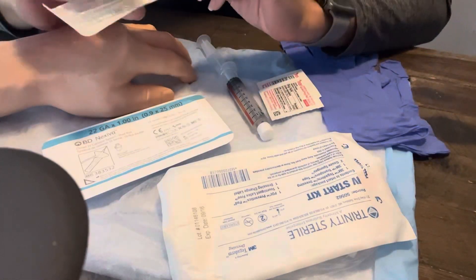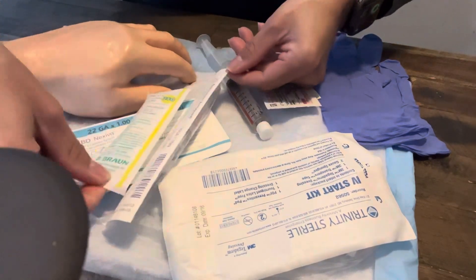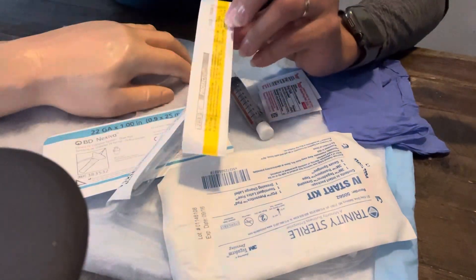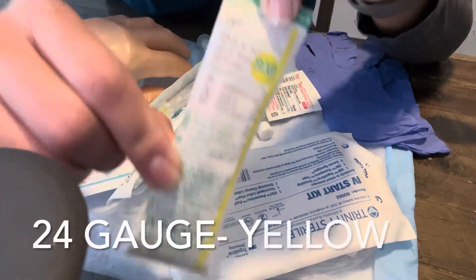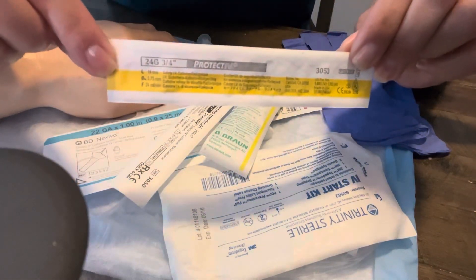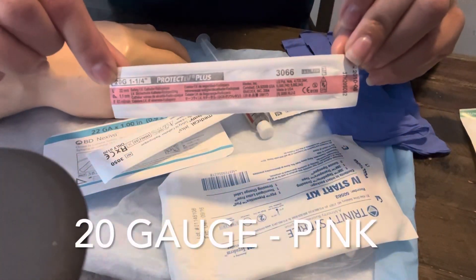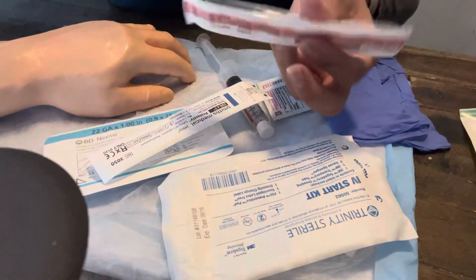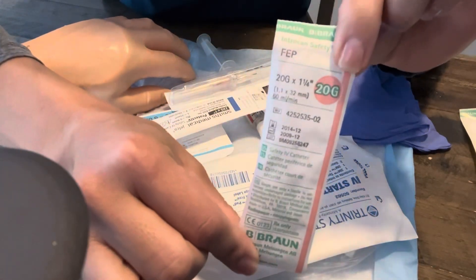One thing to note is the color coding. It doesn't really matter what IV brand you have — every gauge has the same color. For example, this is a 24 gauge and it's yellow, and this is a different brand but it's also a 24 gauge and also yellow. This is a 20 gauge, and if I grab one of these from a different brand, it's pink and also a 20 gauge.